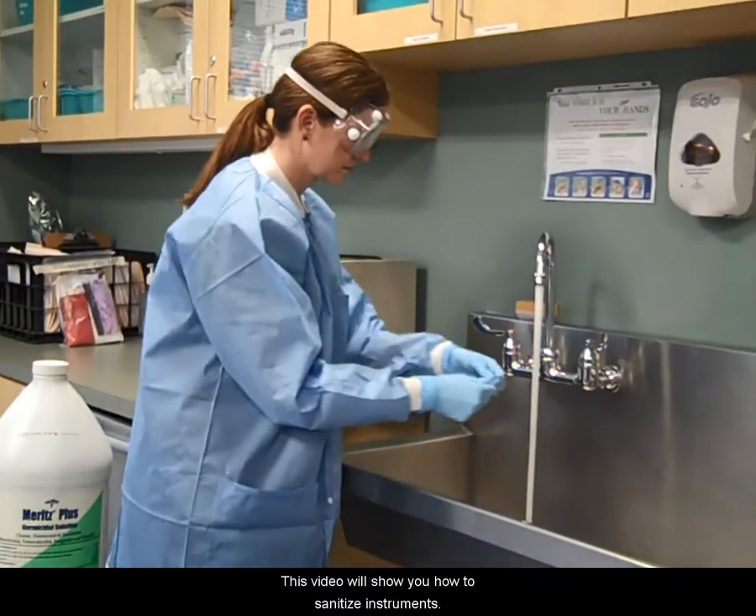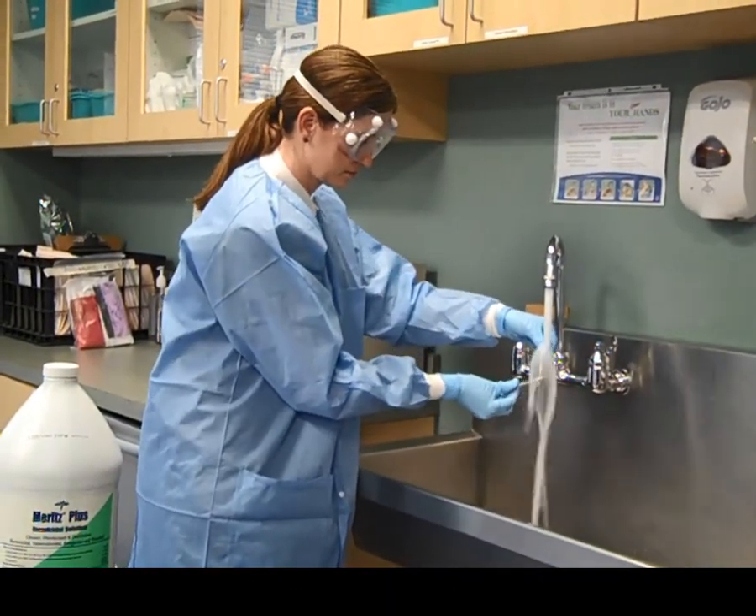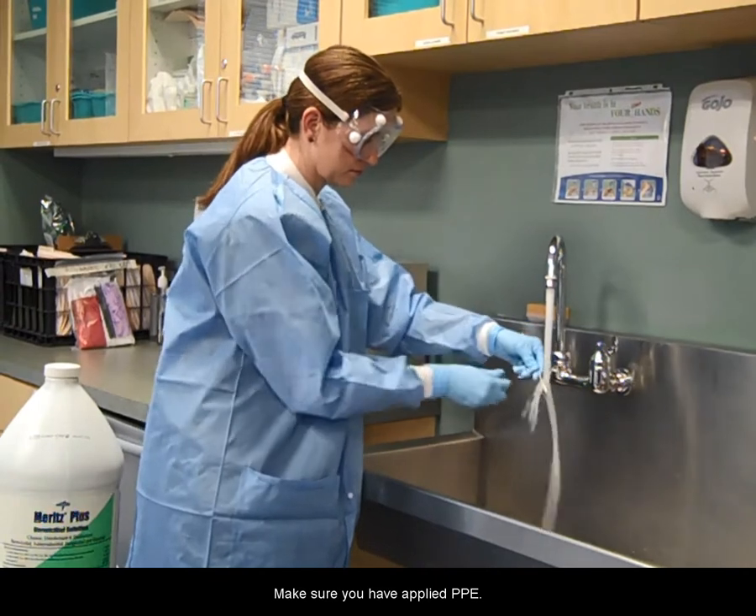This video will show you how to sanitize instruments. Make sure you have applied PPE.